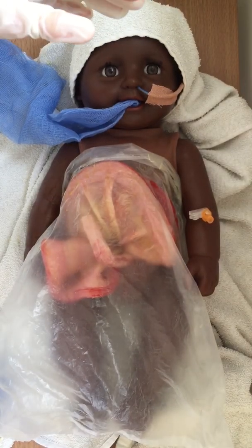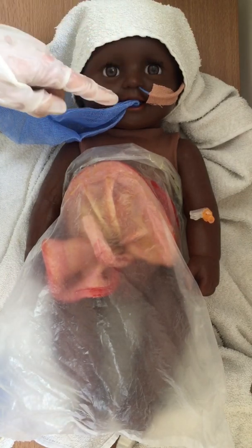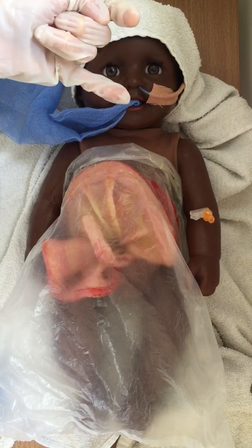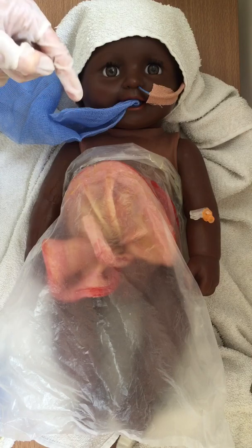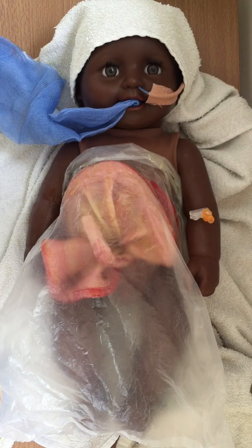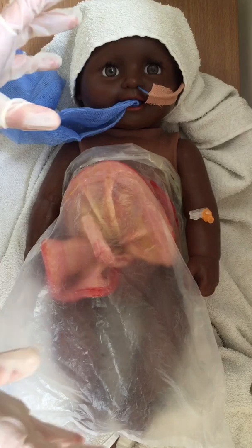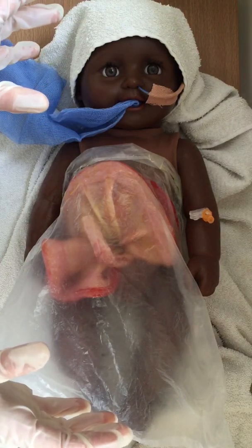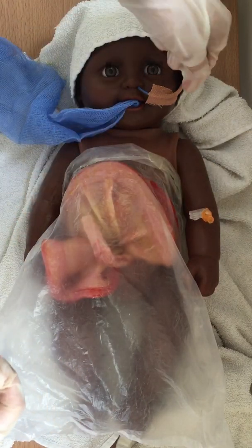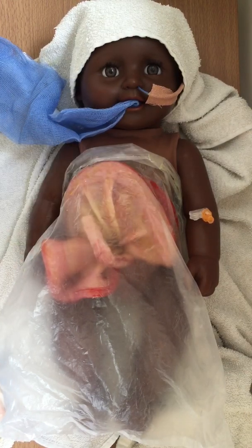Make sure that the baby is on the radiant heater or resuscitaire. You want to gather the appropriate team — someone to help support and comfort the baby throughout the procedure, either with 10% dextrose on a finger to suck or on some gauze as shown here, and ideally another assistant to help the person applying the silo. Do a full ABCDE check to make sure the baby has been fully resuscitated and their condition optimised beforehand, make sure they've had their antibiotics, some paracetamol, and aspirate on the nasogastric tube to make sure the stomach is fully decompressed before you begin.